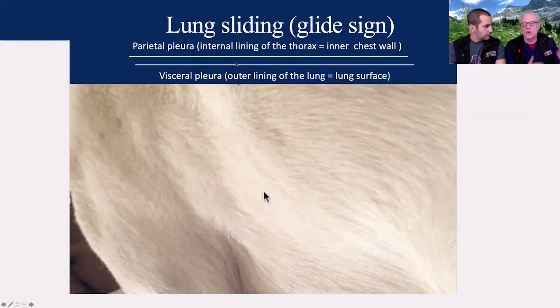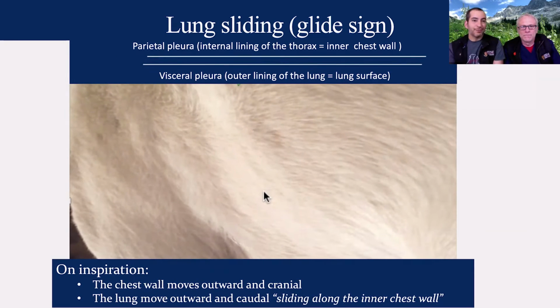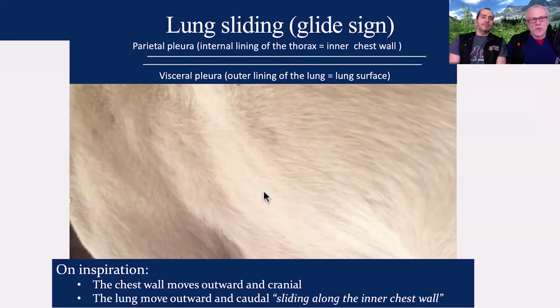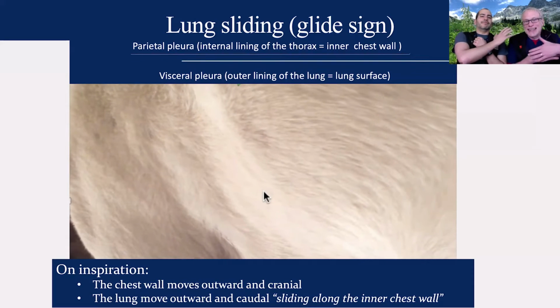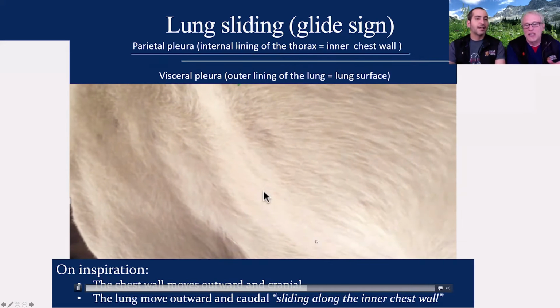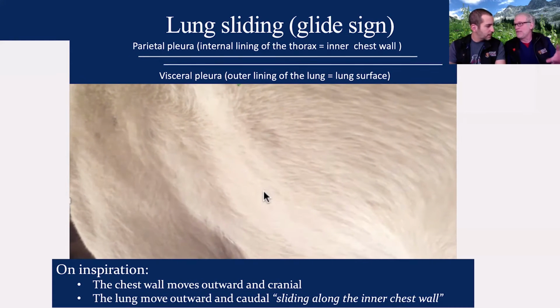When our patient breathes, what happens to those two pleura, Dr. Chalhoub? Well, when the patient breathes, those two pleura are both moving at slightly different speeds, in slightly different orientations, Dr. Boysen. Absolutely. So what actually happens is, if you take a deep breath, Dr. Chalhoub, your chest moves out cranial, your lungs move out caudal. So they're sliding in different, go ahead and take a breath again. They're moving in different directions, Dr. Chalhoub, and we can use that to our advantage, even if we can't see that separation between them, which would be unbelievably nice if we could.